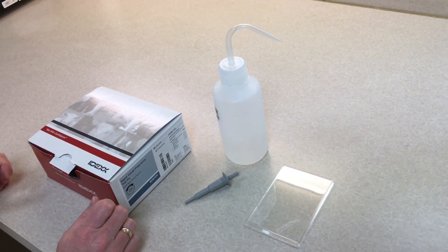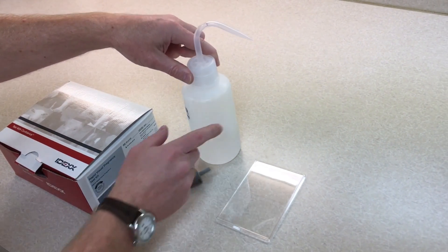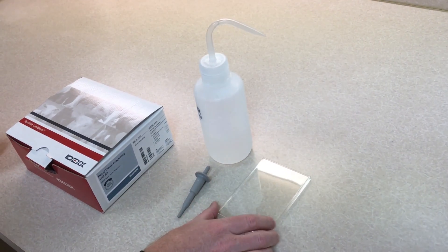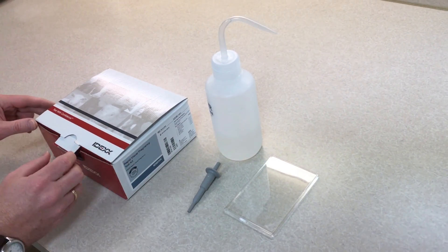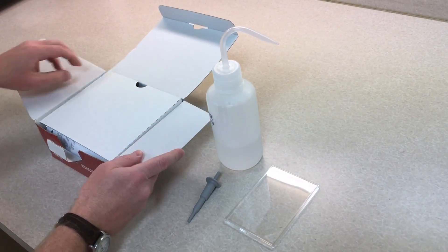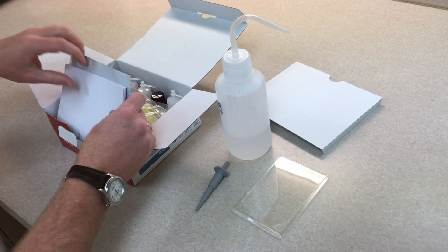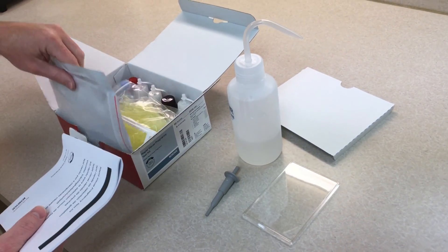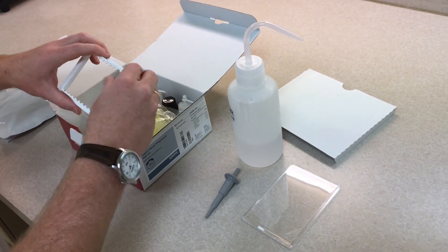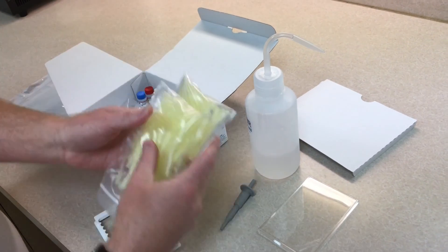The first time you get the kit you will get an accessory pack which has one of these wash bottles. It'll also have a precision pipette and this plastic plate cover. Then of course you'll have the kit itself, which comes with a cardboard cover, your instruction booklet, a bag for extra wells, one of the well holders, and some pipette tips.